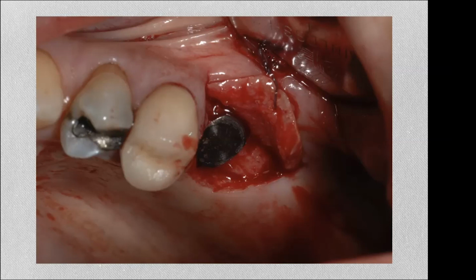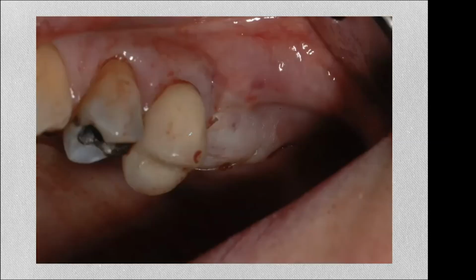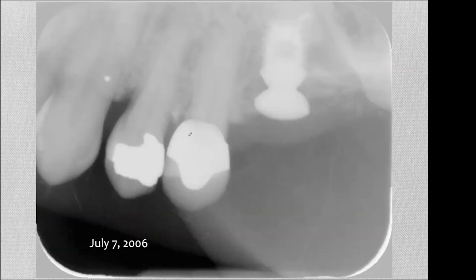This is key. The sinus lift abutment is meant to wedge itself into the crest, and by wedging itself with your tapping into the crest, it gives you added stability. And as a sort of a pedestal, it will hold the implant, even though some parts of it may not be touching a lot of bone, maybe a fraction of a millimeter. That will still give you stability, especially if you have the buccal and palatal walls contacting the implant at the base of the shoulder.